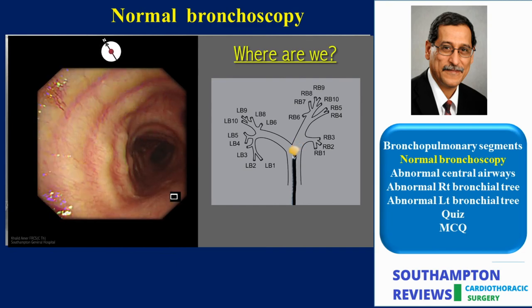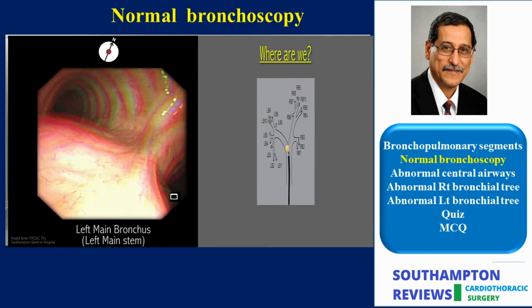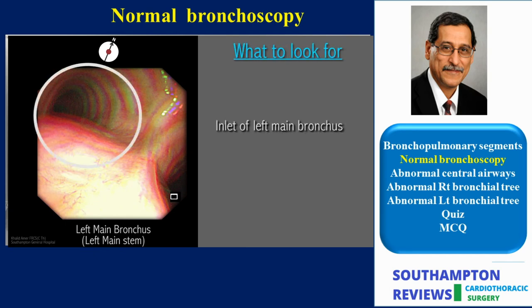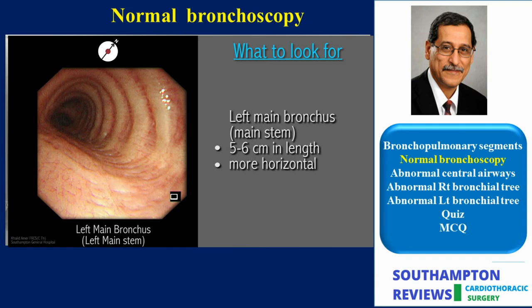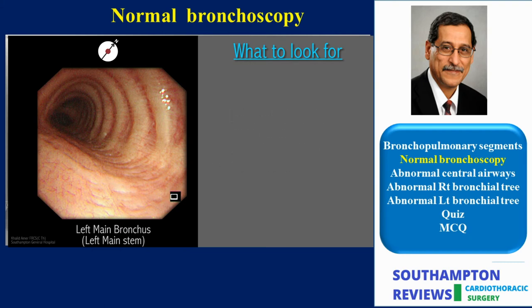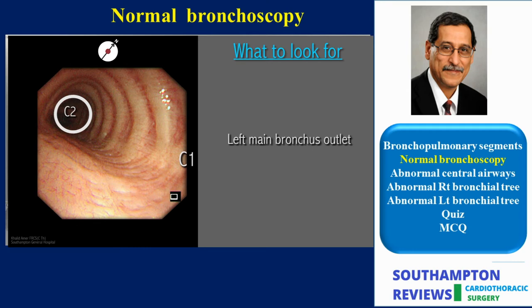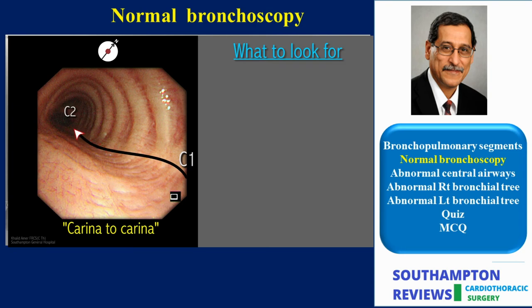The scope is withdrawn back just above the carina in preparation to engage the left main bronchus. The left main bronchus is longer than the right and spans 5 to 6 cm, attending a more horizontal orientation. To define the territory of the left main bronchus we will follow the same principles as before. We have to define the inlet and outlet by identifying the related carinae. The inlet and primary carina are known to us, and one could see at the far end the secondary carina C2 between the upper and lower lobes. C2 defines the outlet of the left main bronchus, and the surface area from carina to carina makes up the left main stem.